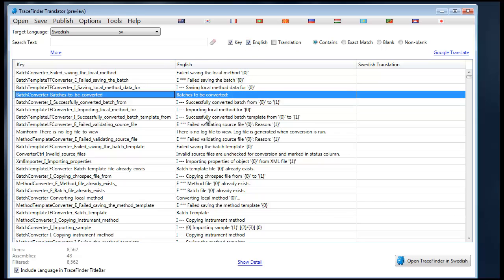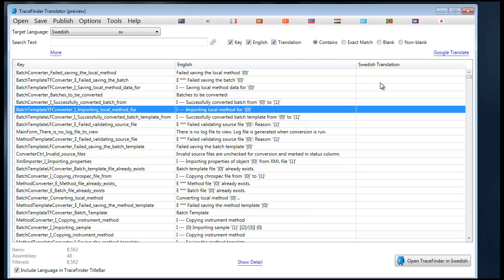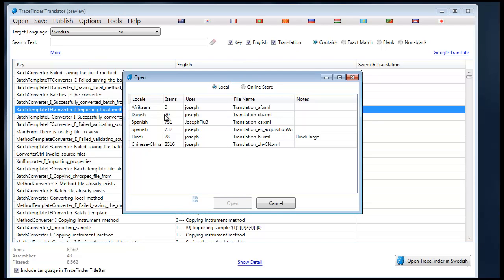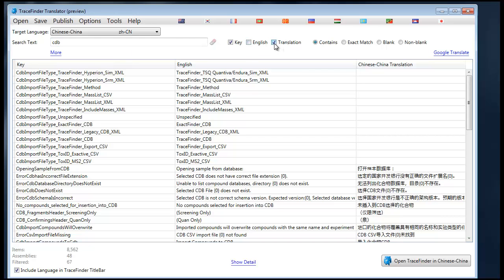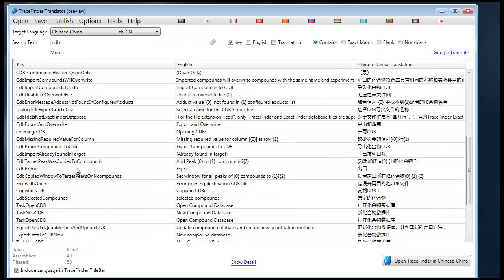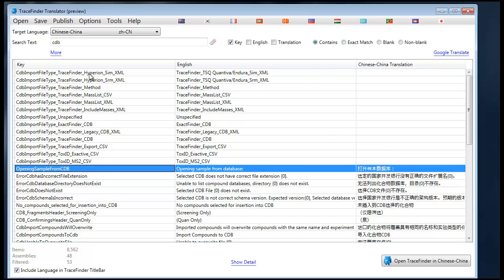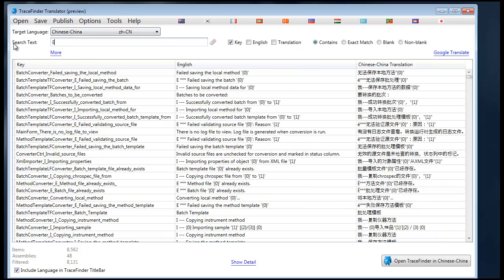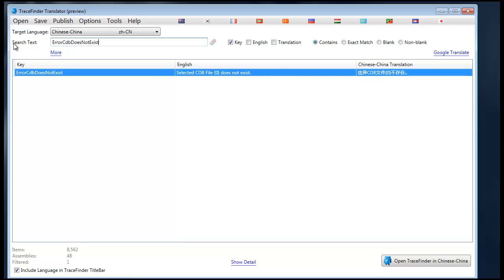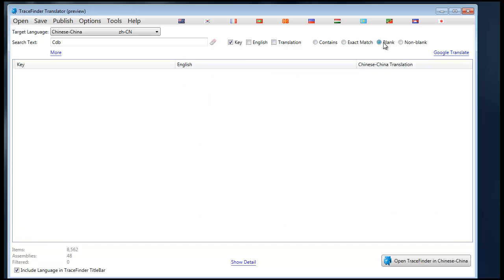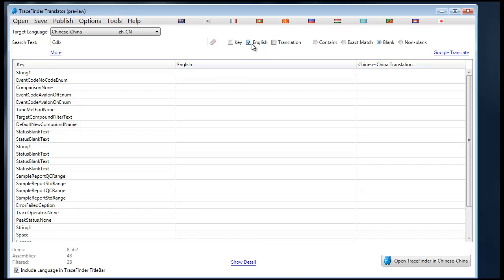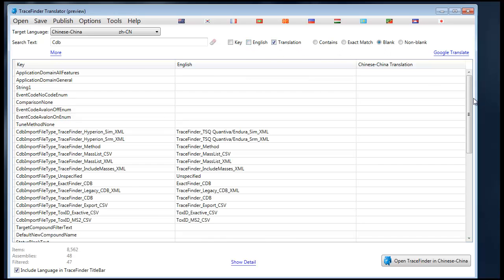You can search through the English, which is the default language, or you can search through the translation. Let me open up the Chinese translation that has more interesting text. So if I wanted to search for all keys that contained the word 'CDB' in them, I could search like so. If I wanted to search for an exact match, let's say 'error CDB does not exist', I could use the exact match option. Or if I wanted to look for all the translations that have not been translated yet, I could search for blank using the blank option.